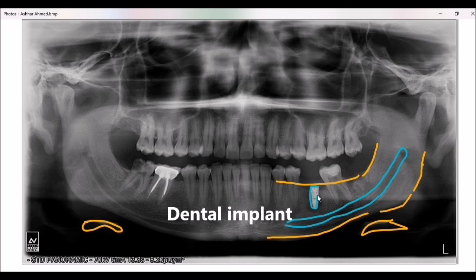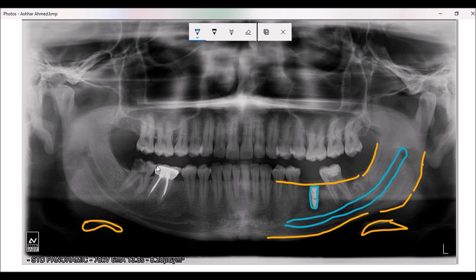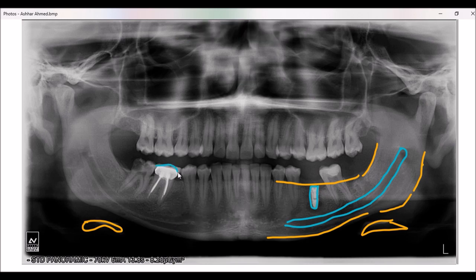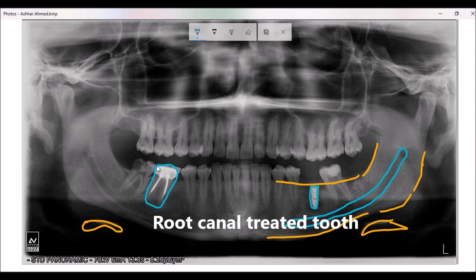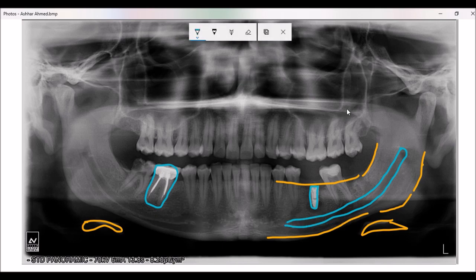You can see an implant over here — this is an implant. And this is a restored tooth, or more precisely, a root canal treated tooth with a crown.